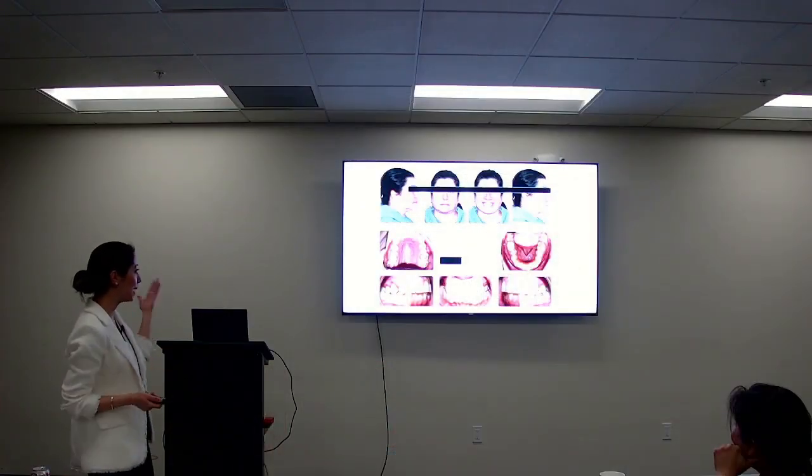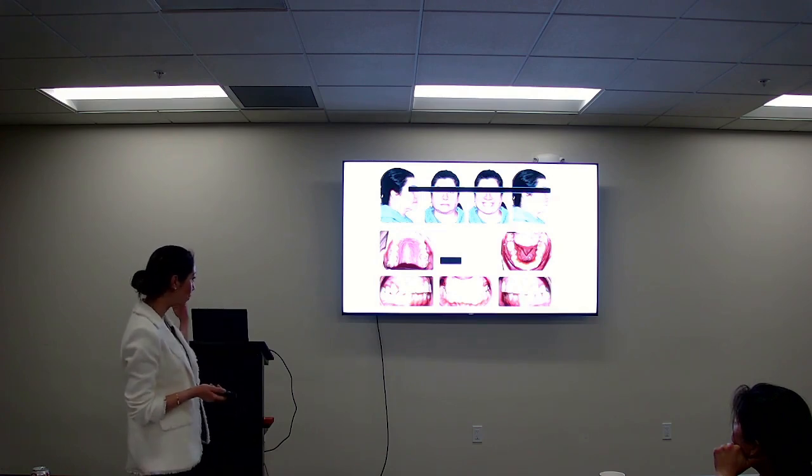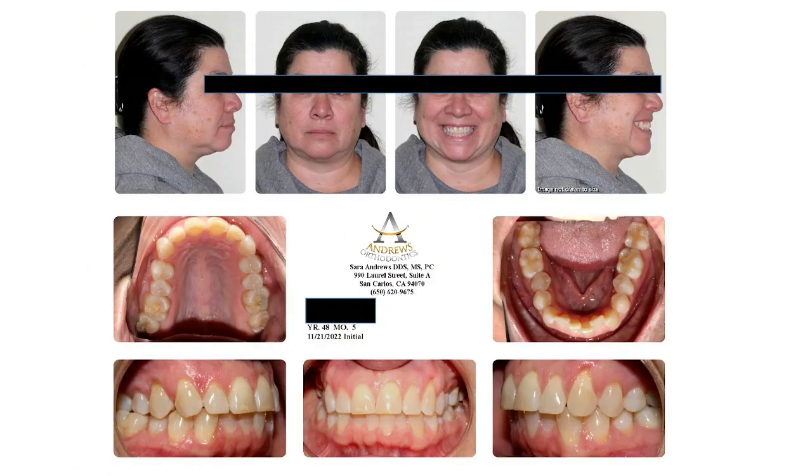This is kind of a typical patient that comes in, right? 48-year-old female, wants to have her teeth straightened before her 50th. Wonderful, wonderful lady, high dental anxiety, moderate mandibular anterior crowding. So the first thing I look at is arch form. Look at arch form when you look at your patient, and look at arch form when you look at your ClinChecks. So the problem, when she was 8 years old, I would have put an expander in her if I had seen her at age 8.